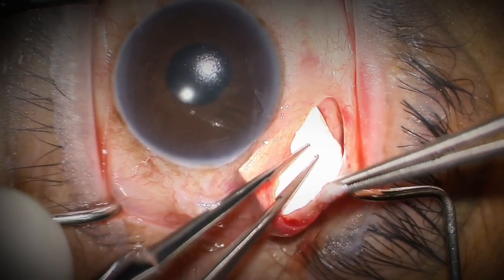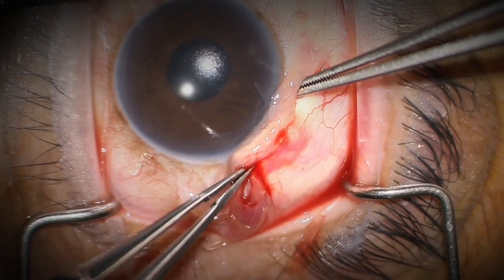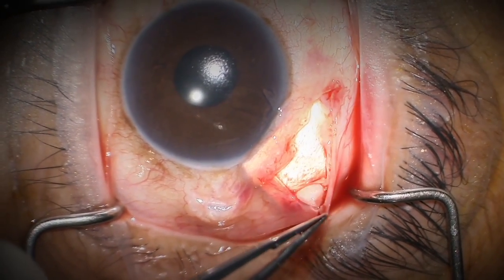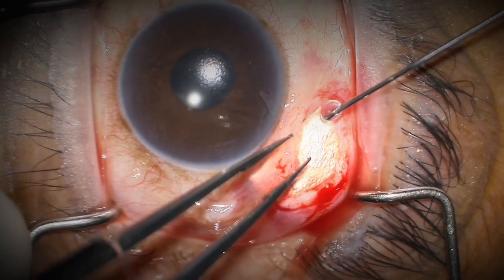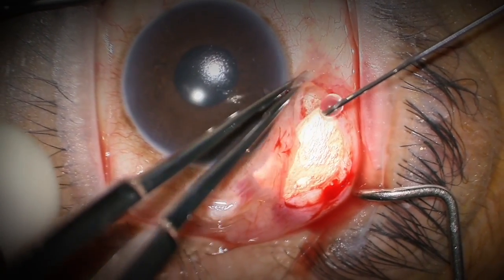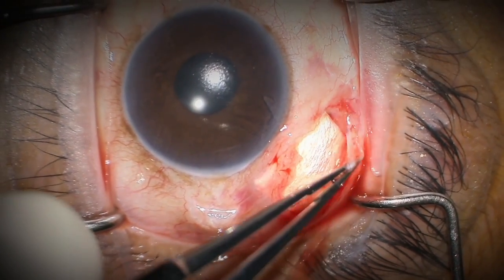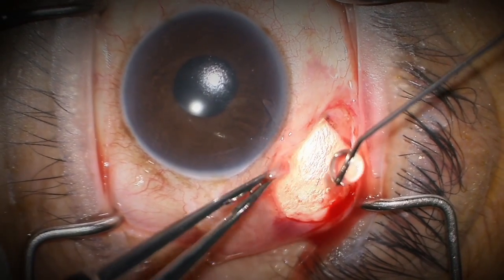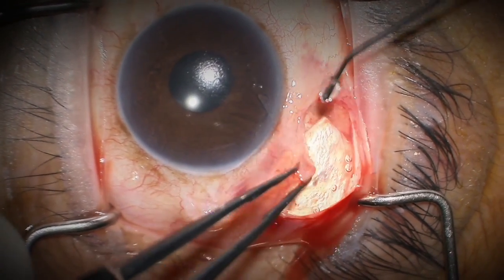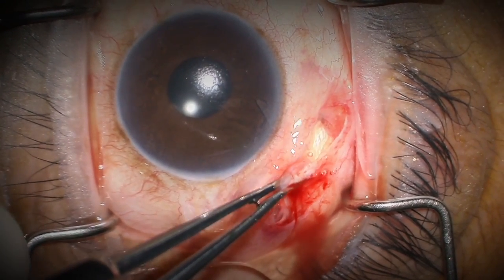Here's a four millimeter by four millimeter scleral patch graft placed in this pocket — these simply don't migrate because there are no forces that would cause them to migrate. Tissue sealant glue is being used around and above the patch graft, which is covering the tube entry site very well. This patch graft is going to prevent erosion.